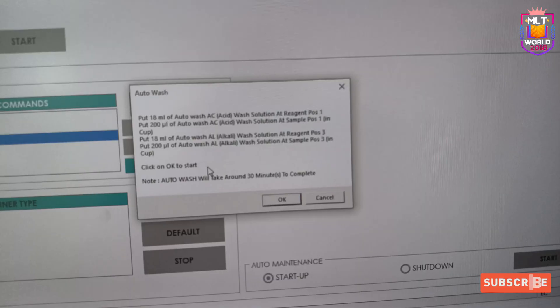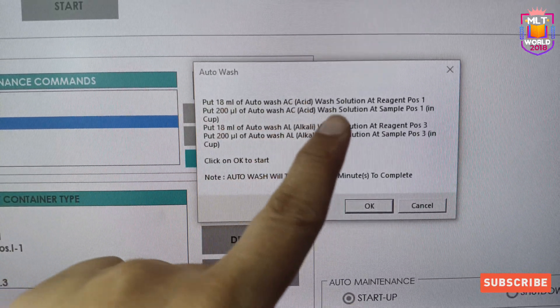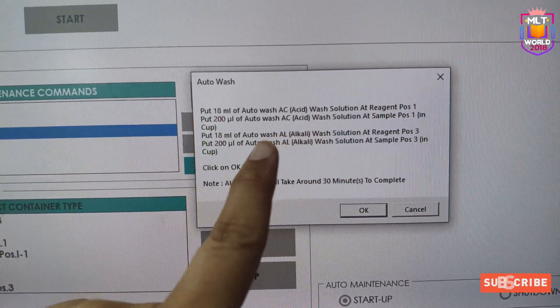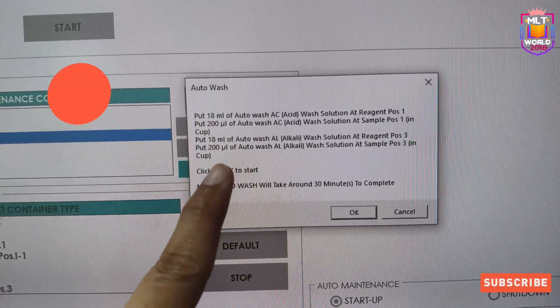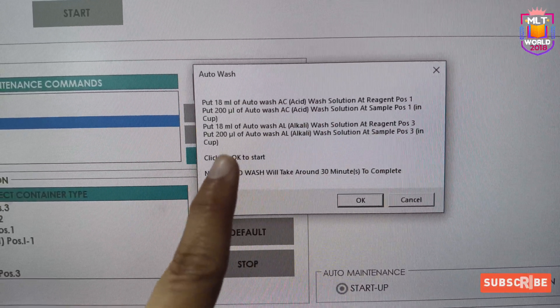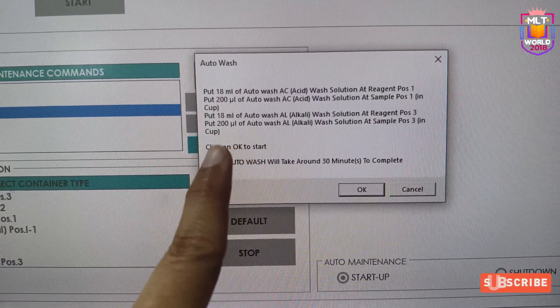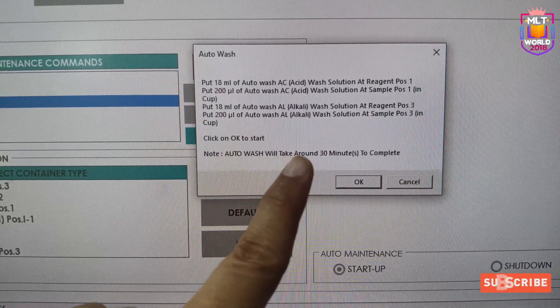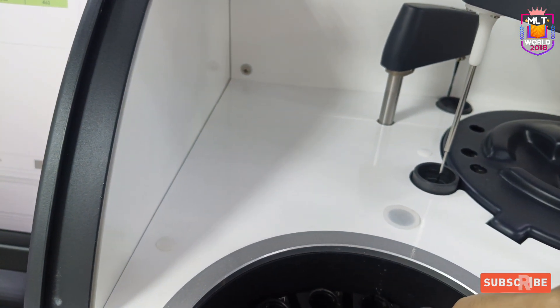When we click the start option, it shows that 18 ml of AC solution must be kept at reagent position 1, and 200 microlitres must be kept in the sample position 1 in a cup. AL solution must be kept at reagent position 3 with 18 ml, and 200 microlitres in sample position 3. After placing everything in their assigned positions, we will click start.